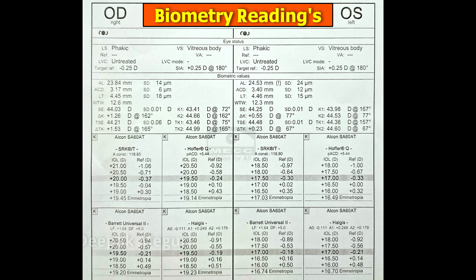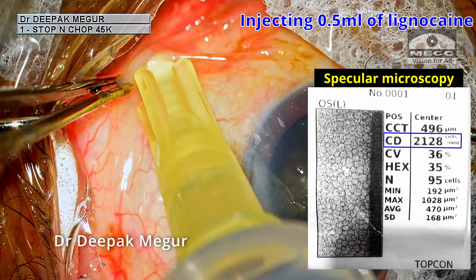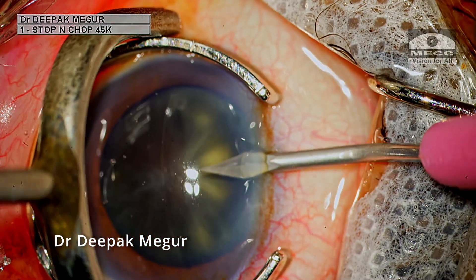These are the biometric readings. A point to note here is that the chamber is quite deep, which is advantageous in this case. I begin by injecting 0.5 ml of lignocaine in the sub-Tenon's space just to keep the patient comfortable, as I expect the surgery to take a little longer time.